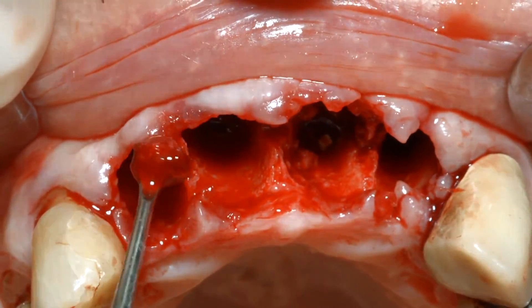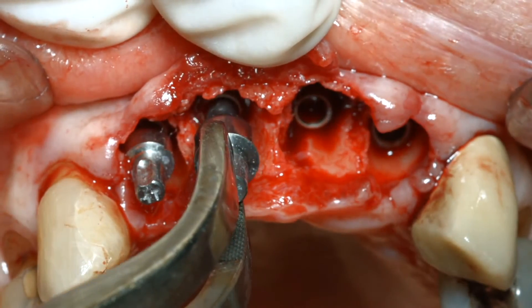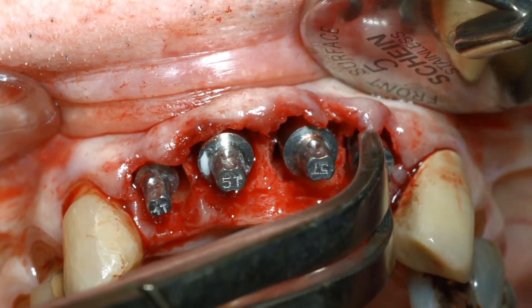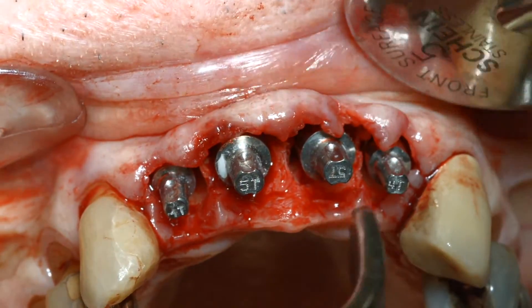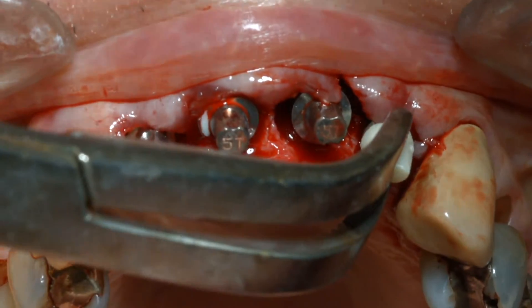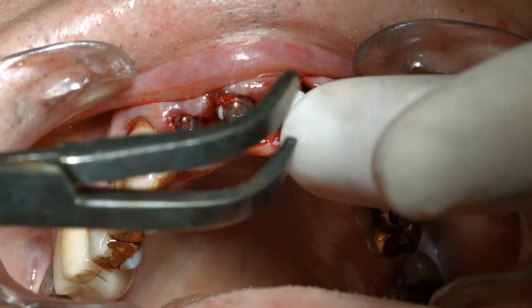Residual bone chips were harvested and removed from the osteotomies prior to the insertion of the implants. Two 4-tall profile universal abutments were gently inserted into the lateral incisor implants, and two 5-tall universal abutments were gently inserted into the central incisor implants. The adaptation of the TRINIA transitional stabilizing prosthesis was confirmed prior to placing the modified or reduced temporization sleeves onto the universal abutments.